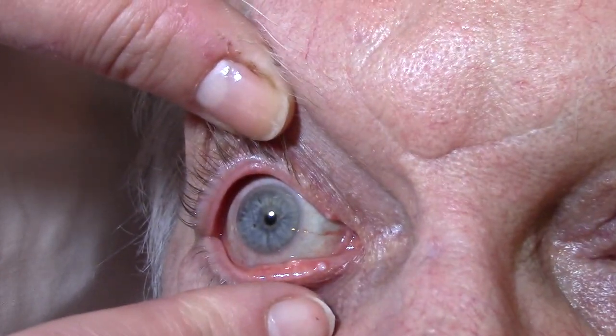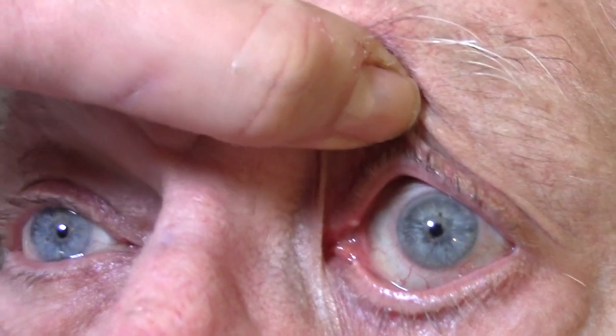It's really good to check the position of the other ones to make sure that they look rather similar. And they do now — they look rather similar. Before, this one was much more prominent.